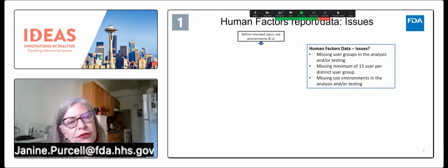So when you're looking to represent that in your human factors validation team, you'll be wanting to recruit those caregiver patient pairs to represent that aspect of use realistically. That's the word you'll see a lot: realistic, naturalistic, representative of actual use are the turns of phrase that you'll see a lot in the feedback we give to you.